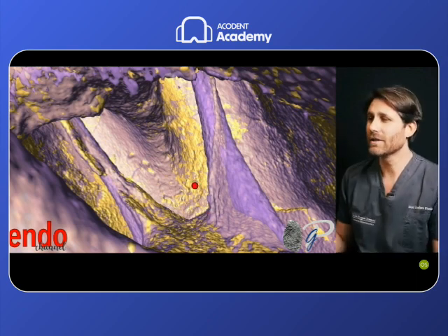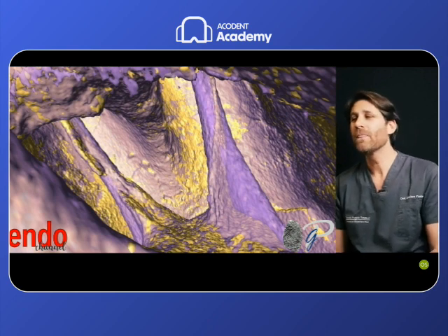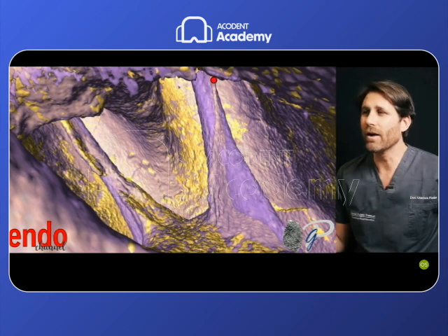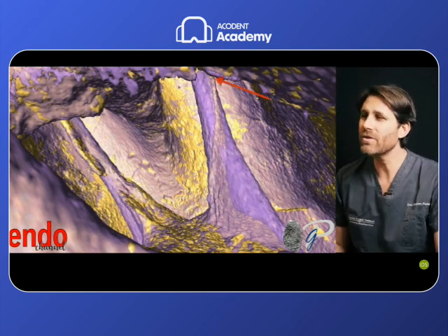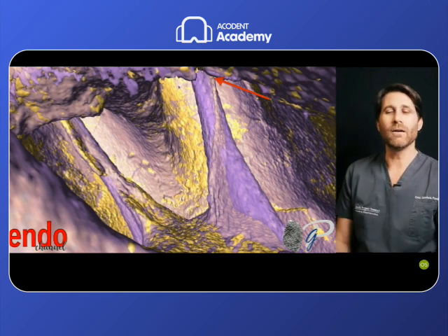file for the scouting without any pre-enlargement of this orifice, it will be very difficult for our manual file, because it's constricted in a very difficult trajectory from distal to mesial, and then it arrives at this point that is the center of the coronal curvature, in which the tip of the file will be constricted by this trajectory without any preoperative enlargement, and usually stops here.